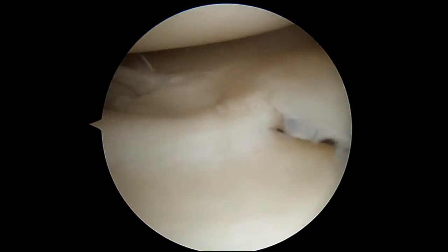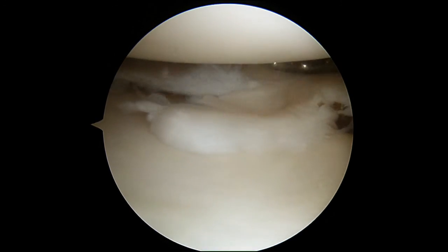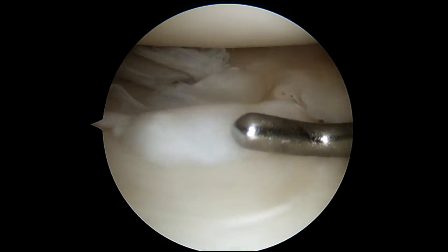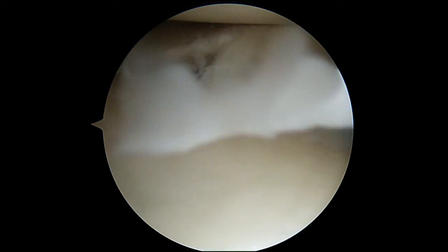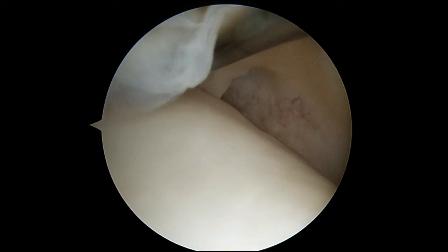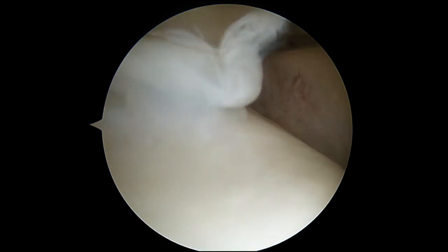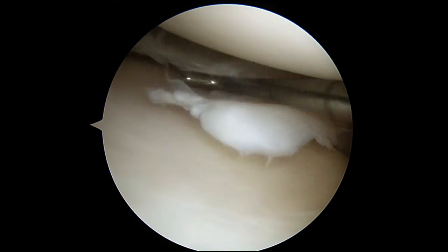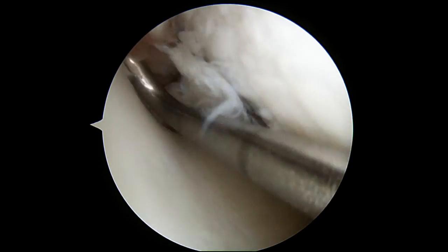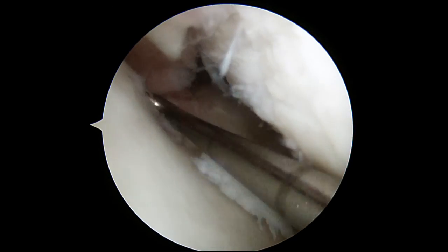Now we're just opening up your knee and you can see the torn cartilage. This is more than a horizontal cleavage tear — this would have kept bugging you. Definitely not something that tends to heal itself and it'll keep irritating you. You can see there's a flap that's folded underneath, and some more fraying of the cartilage, but it's a pretty simple one to treat.